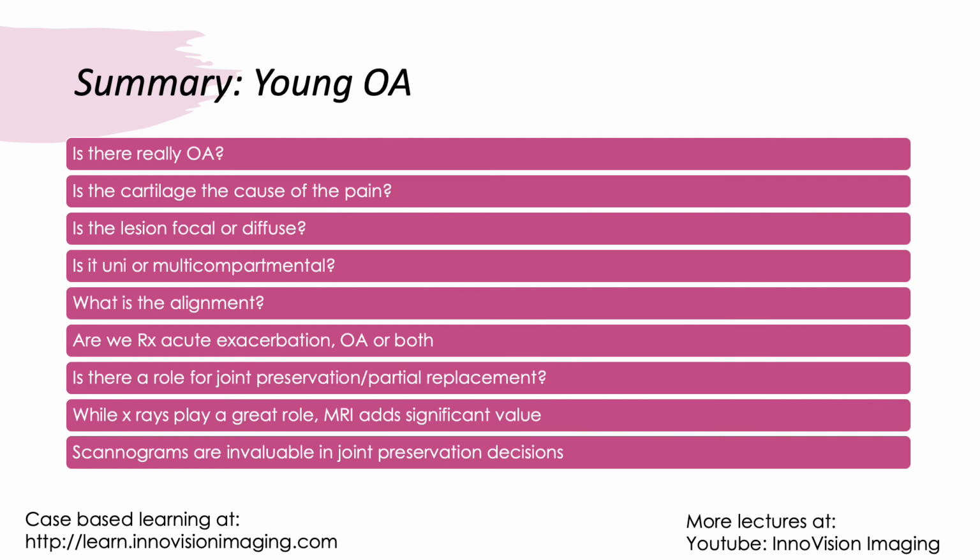So once you understand this entire global appearance of osteoarthritis and the management of osteoarthritis, I think it will become much easier for you to understand the role that MRI plays and the role that you're playing when you actually interpret these scans.